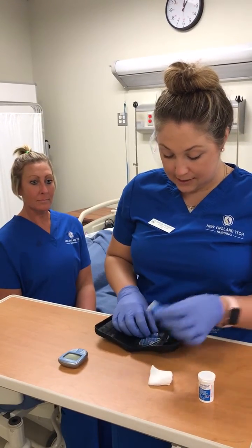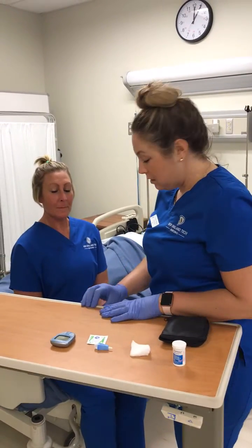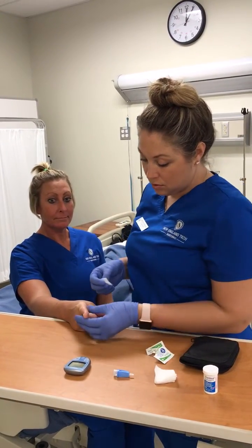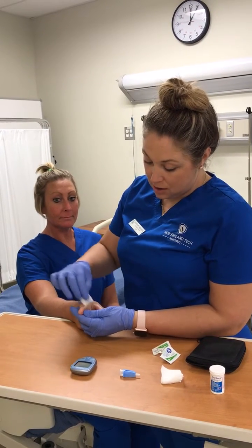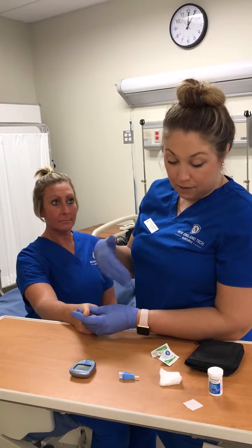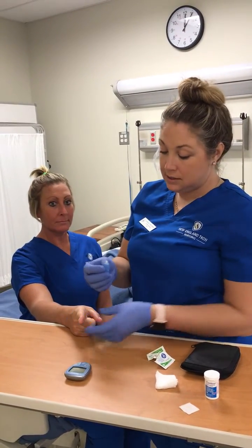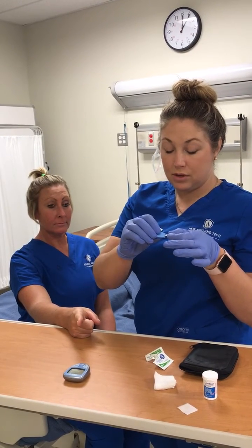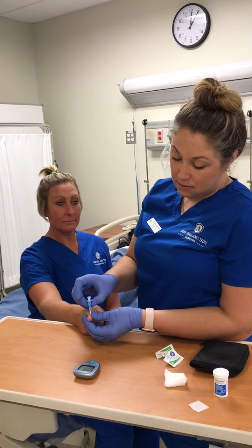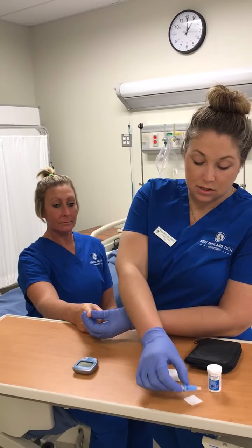Next, I have my lancet and some alcohol prep wipes. I'm going to wipe the patient's finger on the side with the alcohol swab and let it dry for a few seconds. You would then take your lancet, pull the top off by twisting it — for demonstration purposes, I'm not going to prick. Place the lancet firmly against the patient's finger and press down; a needle would come out and prick the side of the finger. Make sure you throw the lancet into the sharps container.